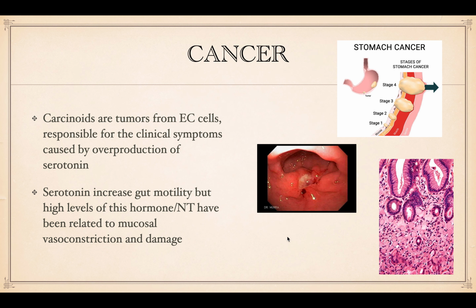And if you can see here, there's going to be all these lumps. This should not be there, it should be smooth. As you can see here, there's irregularity.